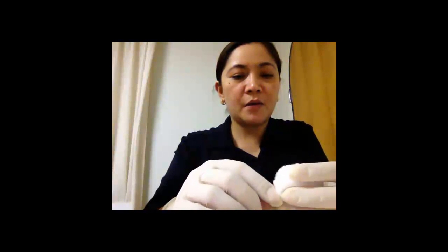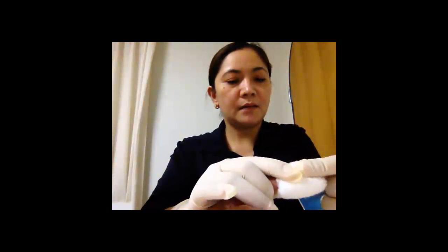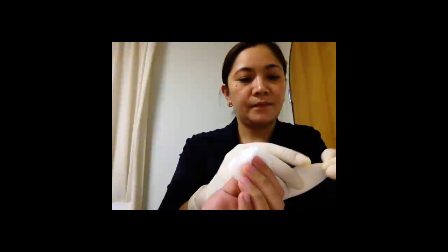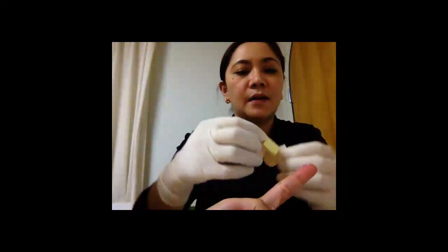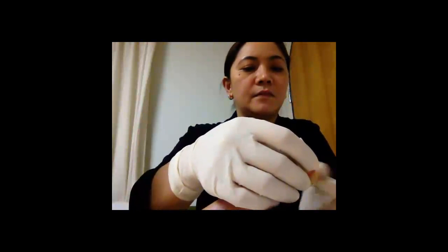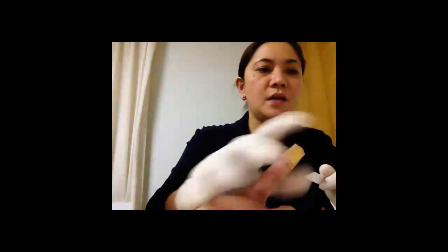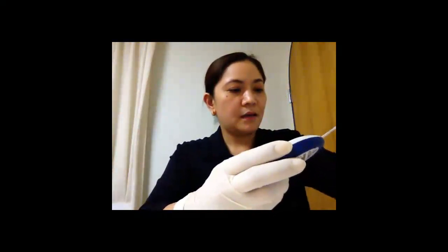Press the finger for about 1 to 3 minutes. When there is no more blood, you can ask your patient to hold the cotton ball. By the time the result of the blood glucose test appears on the machine, apply the band-aid. Discard the lancet into the sharp box. You can then read the result of the test and remove the glucose strip.